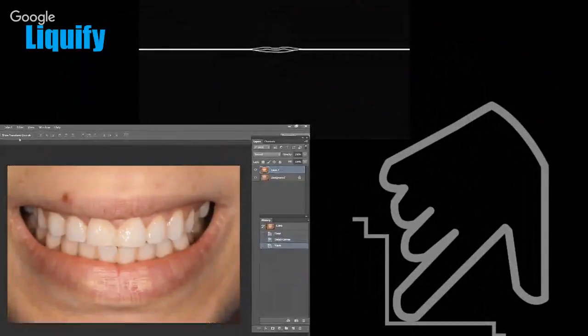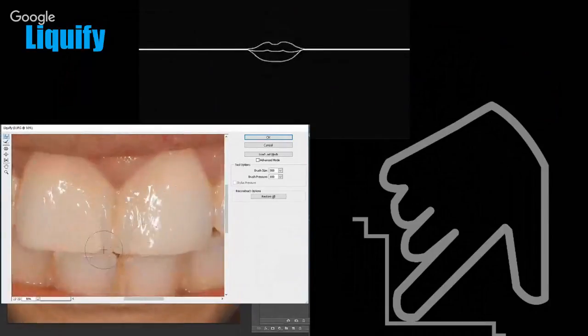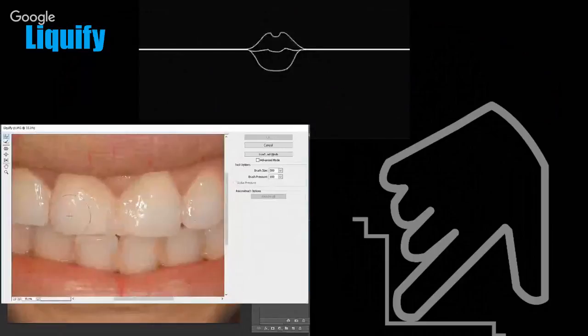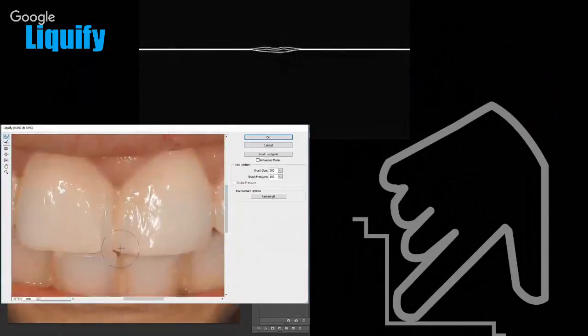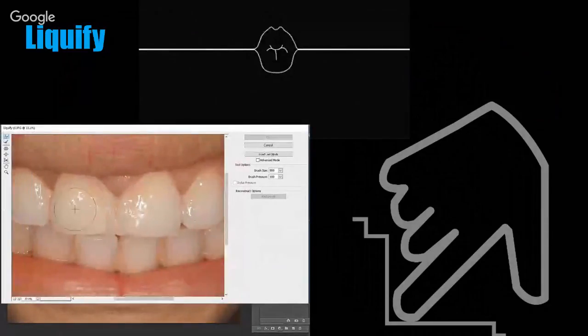So the first really amazing tool in Photoshop, that's called the liquefy tool. The liquefying tool is going to allow you to move things. You know, you've seen those pictures of ladies trying to make themselves look slimmer on Photoshop, and then you notice that maybe there's a car inside of that lady's waist, or a table which is stretching inside of her arm.